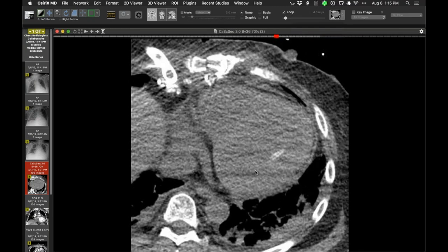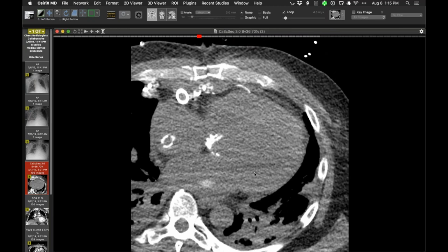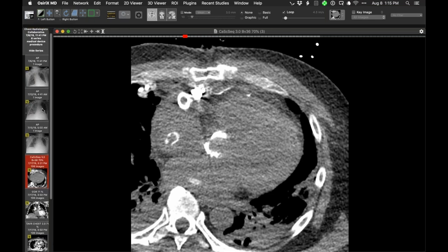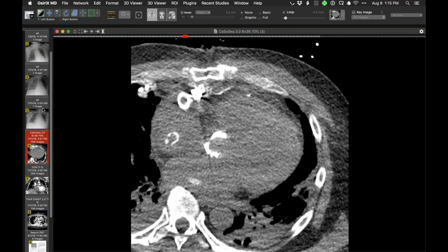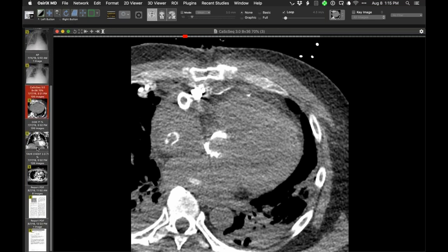So it's an additional thing that's placed at the time of surgery in this context, typically via the right superior pulmonary vein into the left ventricle. So this turns out to be a left ventricular vent. That's what surgeons call that. So here is the context.